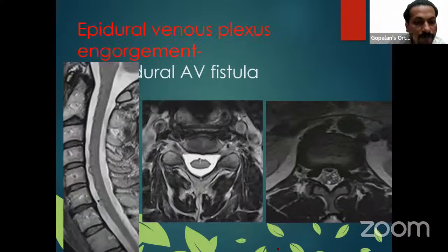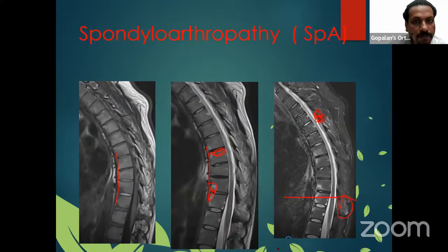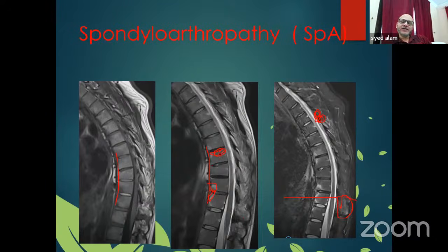And Syed, how to differentiate between an Anderson lesion and tuberculosis? Okay, that's a good question. In TB, as I said, the end plate is involved, the disc will be maintained. So maybe you confuse it with Anderson, but in most TB there will be some psoas or paravertebral abscess, because TB involves the end plate, then it goes to the paravertebral area. So that is very diagnostic of TB. That is a feature of TB. Otherwise, it may be difficult. So epidural space collections, these things are too.